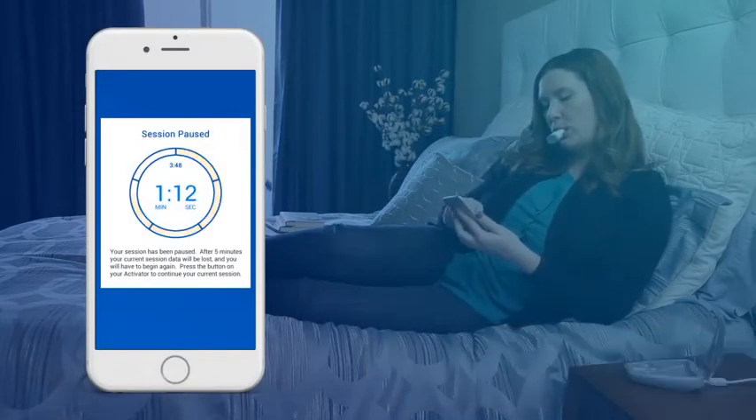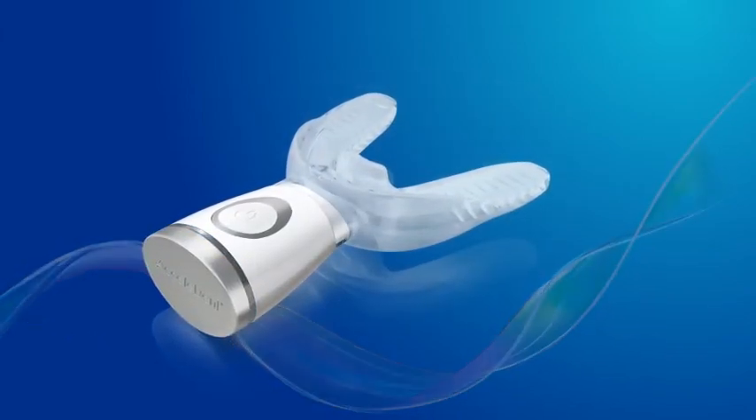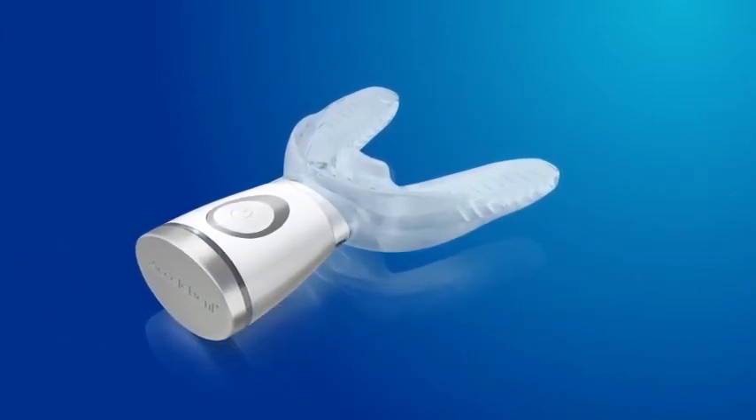You will be able to monitor your time to ensure your treatment session does not reset. After 5 minutes of being paused, AcceleDent Optima will operate for a full session of 20 minutes at its next use. After 20 minutes of treatment, the micropulses will stop and the LED status indicator will automatically turn off.